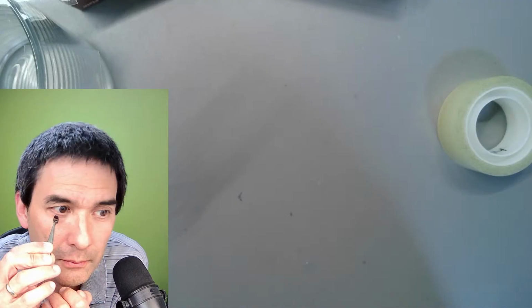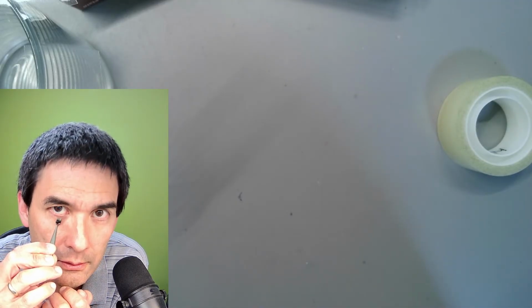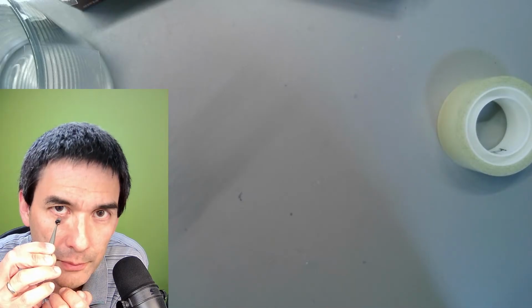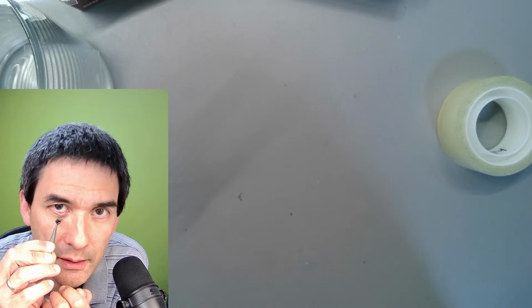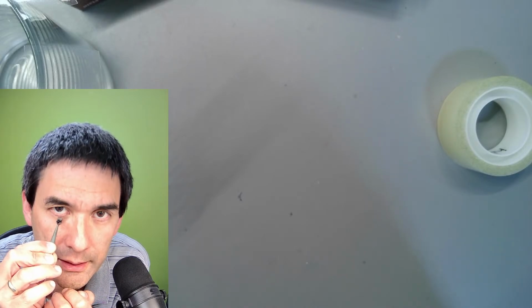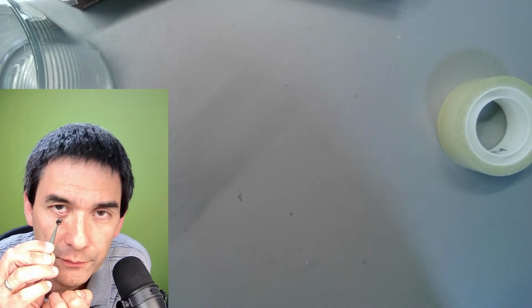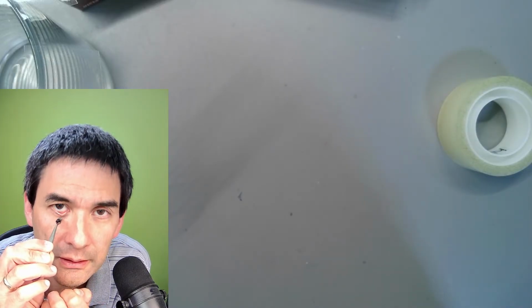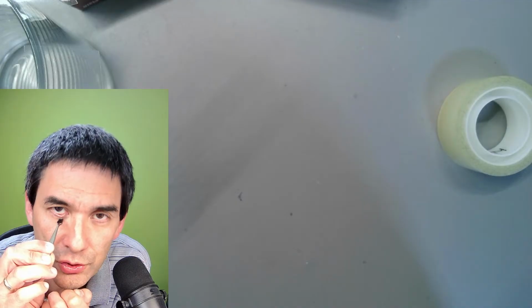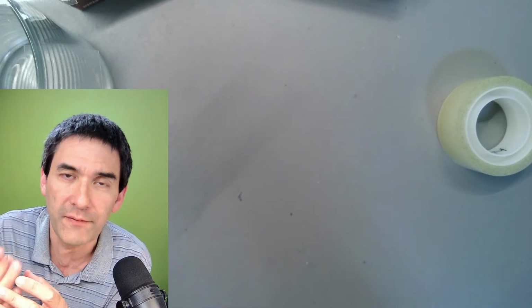And you keep on doing this maybe for a couple of seconds or a minute. Don't rip them out, but carefully rotate. This is not a method that I invented, but this is what some doctors are using to actually get them out. They don't use those tweezers, but they have different types of tweezers. They're wrapping the eyelashes individually around those tweezers, and this squeezes out the face mite.